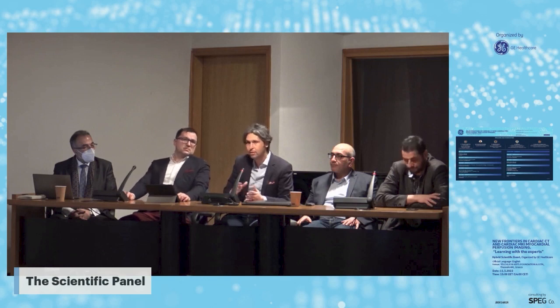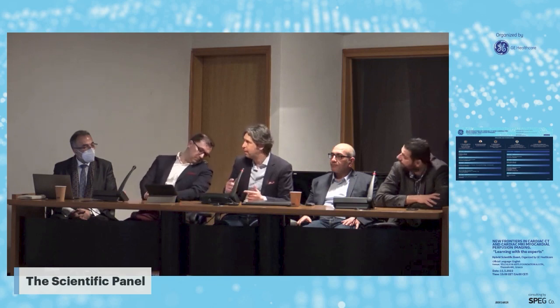I think that from my side, of course, I talked much more about CMR. We have seen also through the very didactic clinical cases the importance and the role of CMR. All in one, we can assess perfusion defects, we can see viability, the function, hypertrophy, thinning, and maybe in the near future also the coronary arteries. The message is to learn how we can use all these techniques in our daily clinical practice in the best way for our patients.